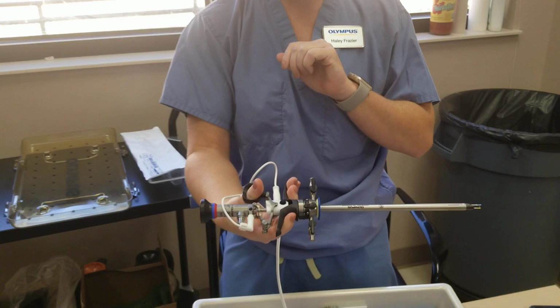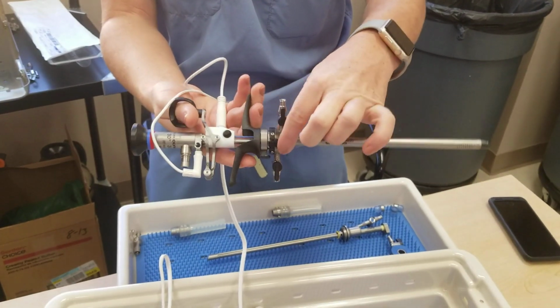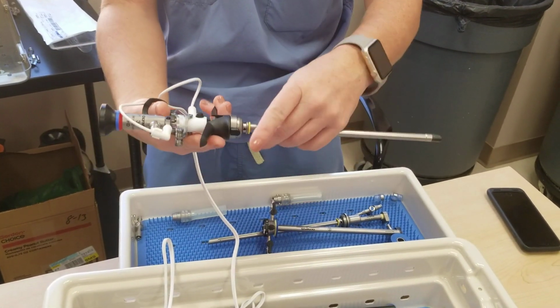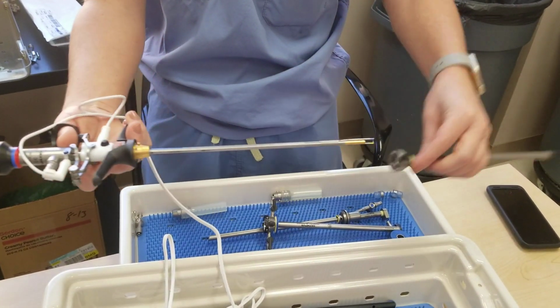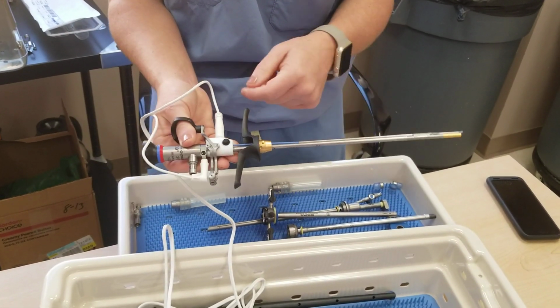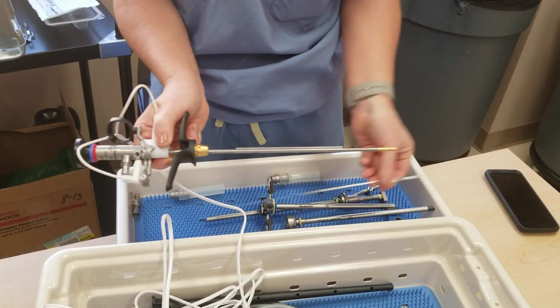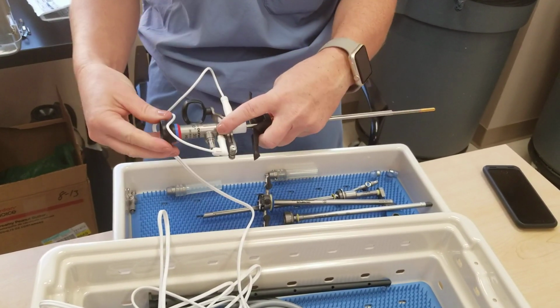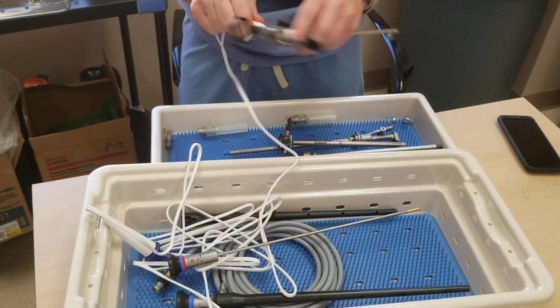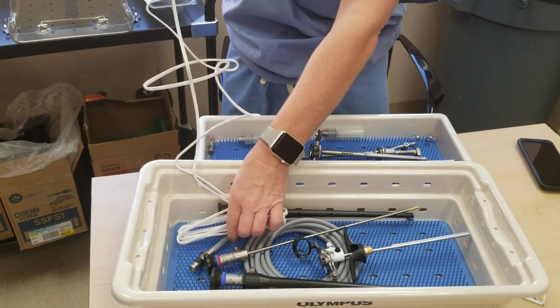To disconnect it, everything just snapped in, and then you have to press something black to remove it. So the outer sheath, you press and hold these two to remove. You press that little part on the top here. And then these two dots, buttons. The button closest to your electrode releases that. And then the button closest to your lens releases that. And then you will just discard your electrode and your cable. And that's it.